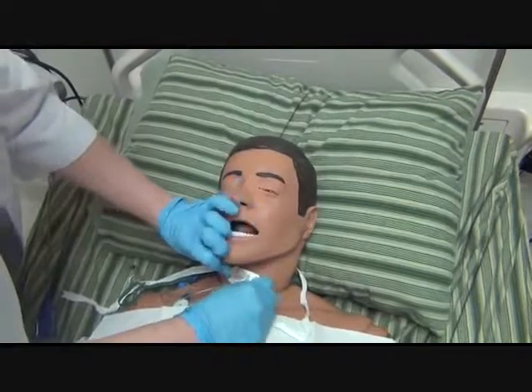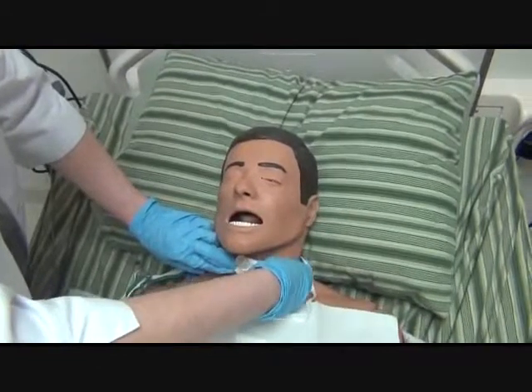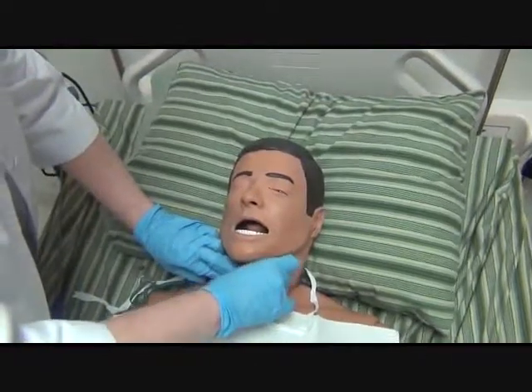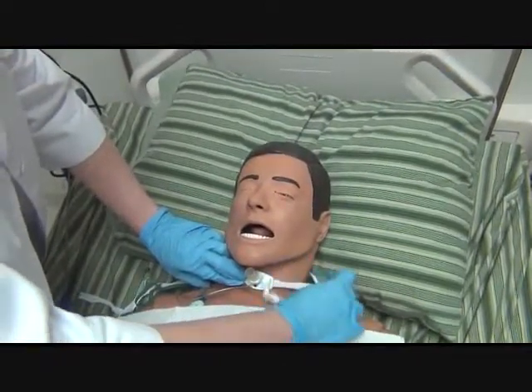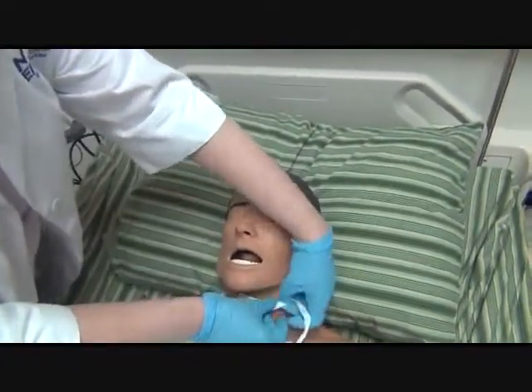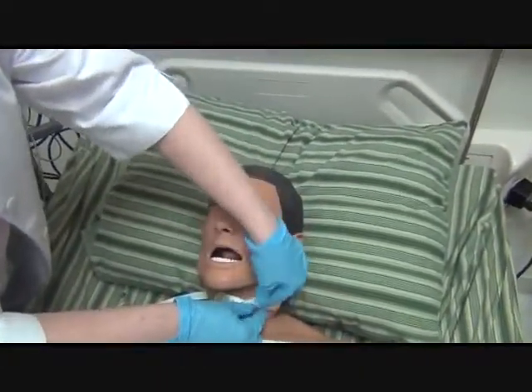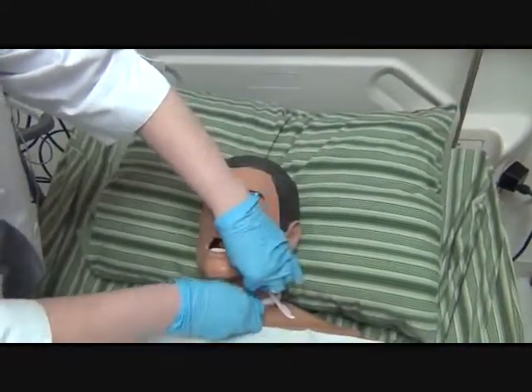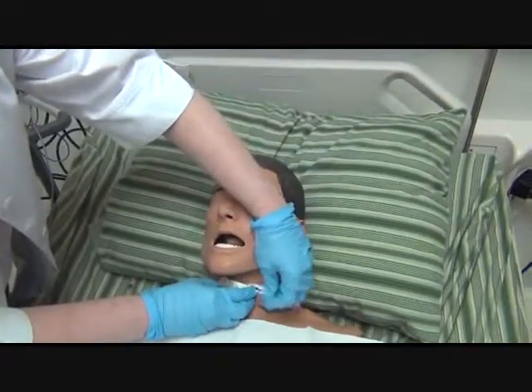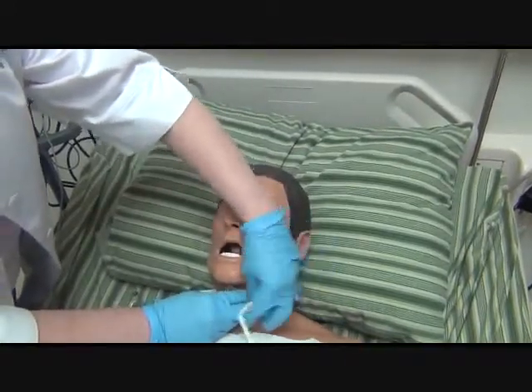If you're having difficulty with your tie, the tweezers come in very handy for grabbing the tip of that and helping. You do want to be careful if you're using a tweezer that you don't get that near the patient's eye in any way. I now want to make my square knot. So that's right over left, left over right. You mean for this to stay in, so we are going to put a pretty secure tie there. If you need to, make a third tie.